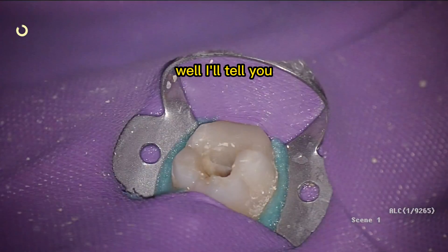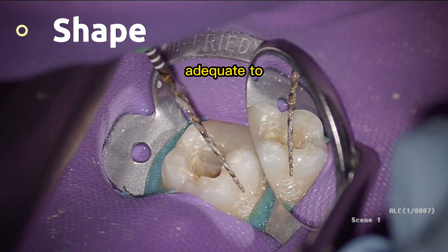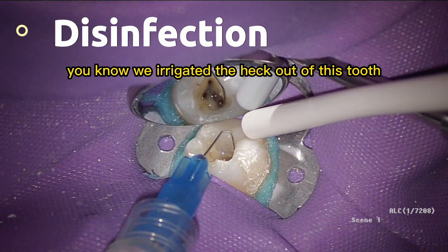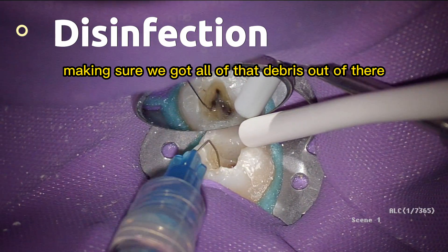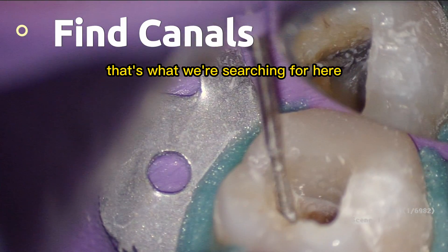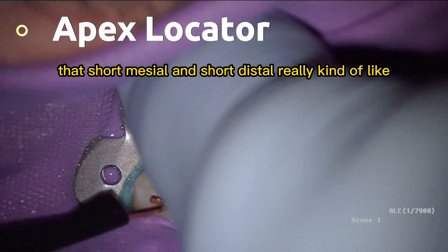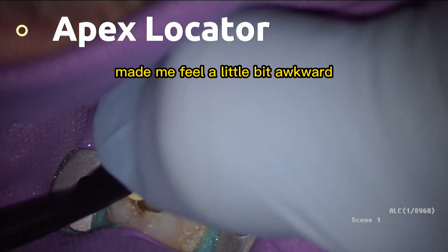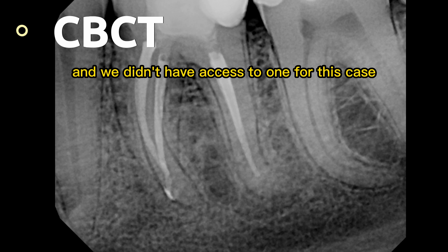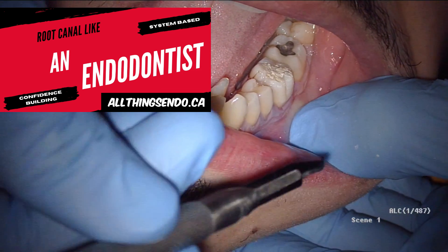Here's what I learned from this case. First, shaping — you've got to make sure you have adequate apical shape to get your disinfectant down there. We used full-strength sodium hypochlorite and irrigated heavily to clear all debris. Second, you've got to find all the canals — we confirmed there was no middle mesial here. Finally, this case reinforced trusting my apex locator. Being short on both the mesial and distal made me uncomfortable, and a CBCT probably would have helped — though we didn't have access to one in this case. Most of the time we take one anyway.